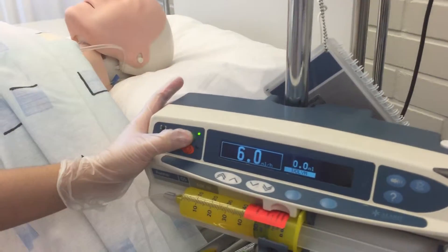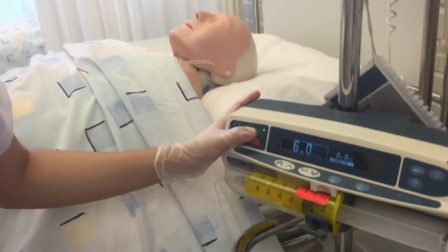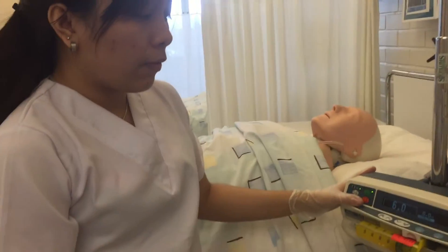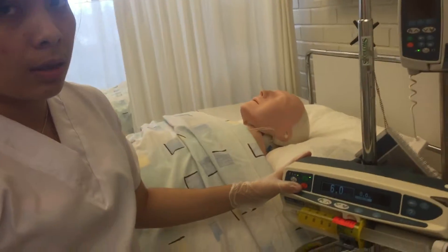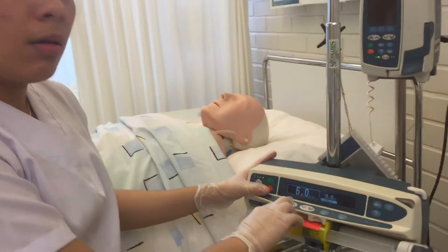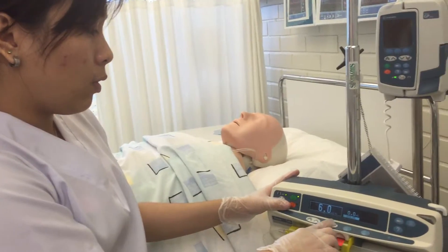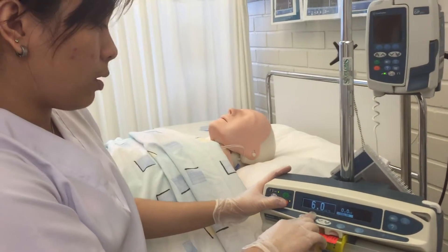Wait until you see changes from the bolus you have given. If the patient is still in pain, you can increase the rate to 8, since we are still within range. To give 8, just press stop and adjust it here.